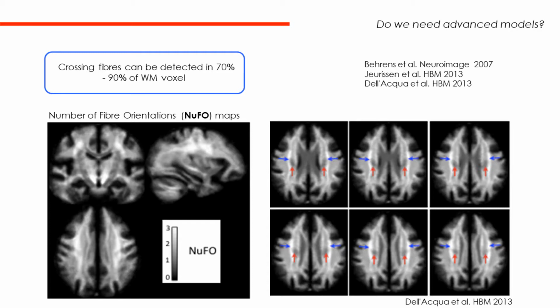So this is an atlas we created by averaging different subjects. You can see where there are 2 or 3 fibers, essentially everywhere except the corticospinal tract here and the corpus callosum. Everywhere else you have crossing. So you see, it's really important to take these methods into account.